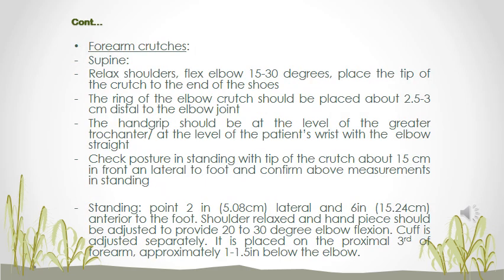How to measure for forearm crutches can be done in supine or in standing. In supine, instruct your patient to relax their shoulders. Flex their elbows slightly, to 15 to 30 degrees. Place the tip of the crutch at the end of the shoes. So tip meaning the bottom of the crutch, to the end of their foot or shoe, what they are going to walk with.